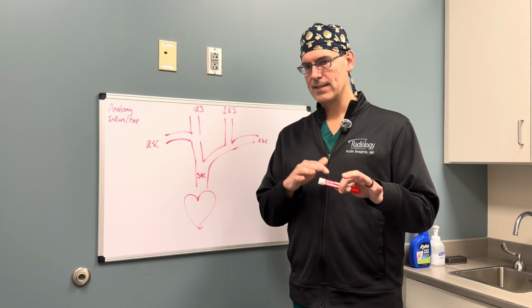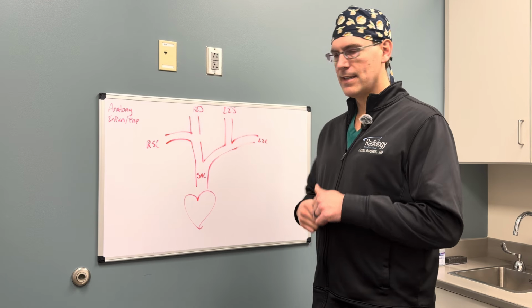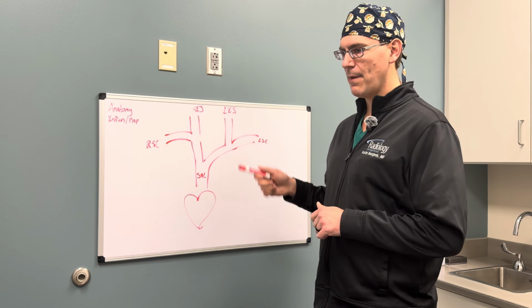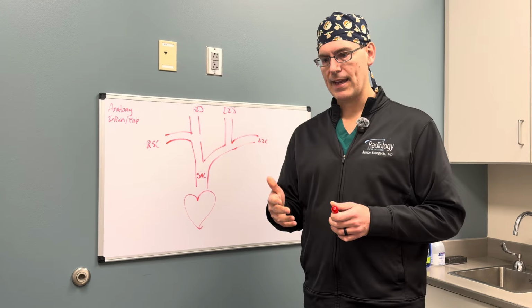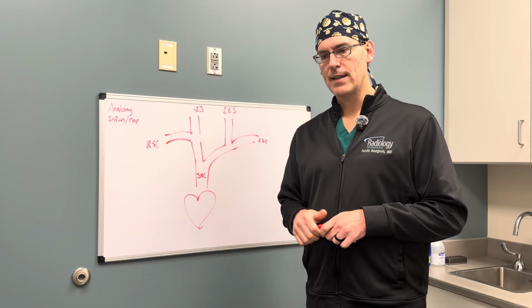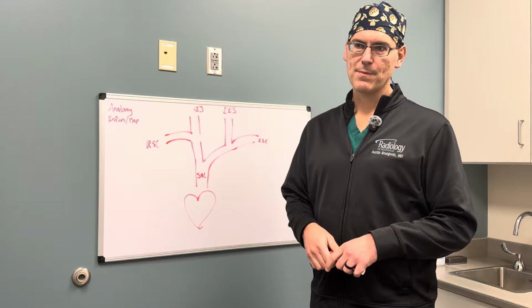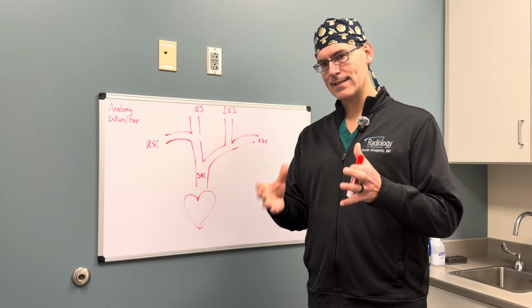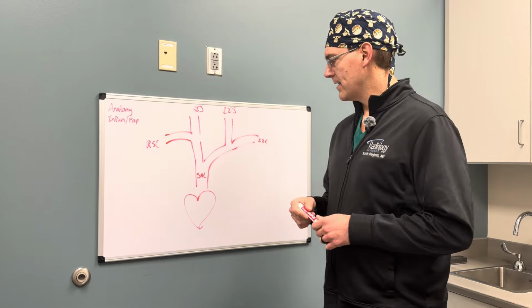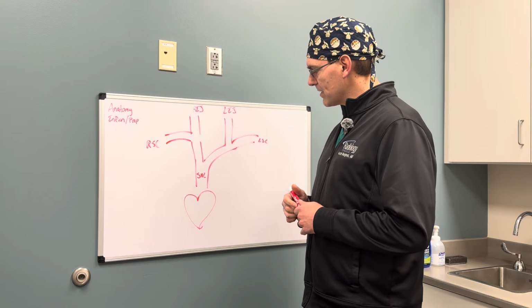And so the main thing we think about in central vein access is this phenomenon that I'll describe here. Wherever a man-made object touches a vein, it has potential over a long period of time, meaning multiple months, to create a foreign body reaction. And that more or less means scar tissue forms and thickens the wall of the vein and can create narrowing in the vein.